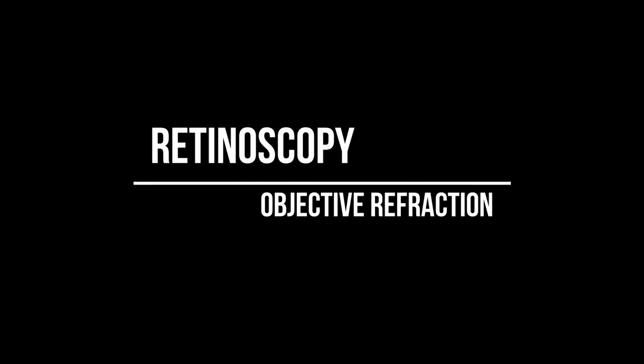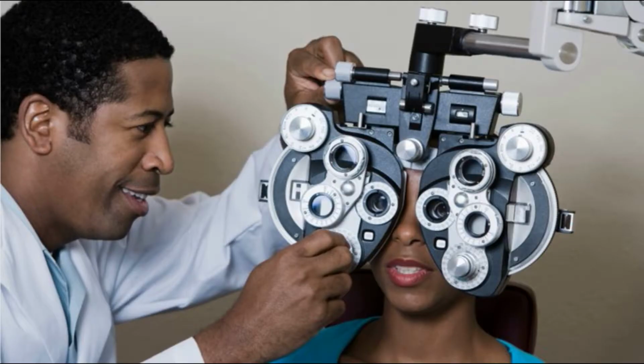The second is objective refraction, which we call retinoscopy. And this is where the refractive state of the eye is determined without input from the patient. So basically, we rely on our own performance, on our own equipment. And so we should be very good at it. Ideally, we should perform this retinoscopy or objective refraction before the subjective refraction. So this should be performed first and then we do the subjective refraction.